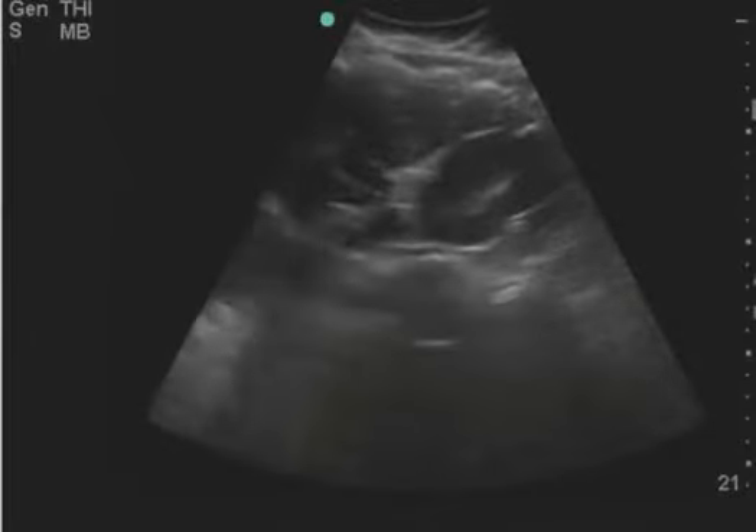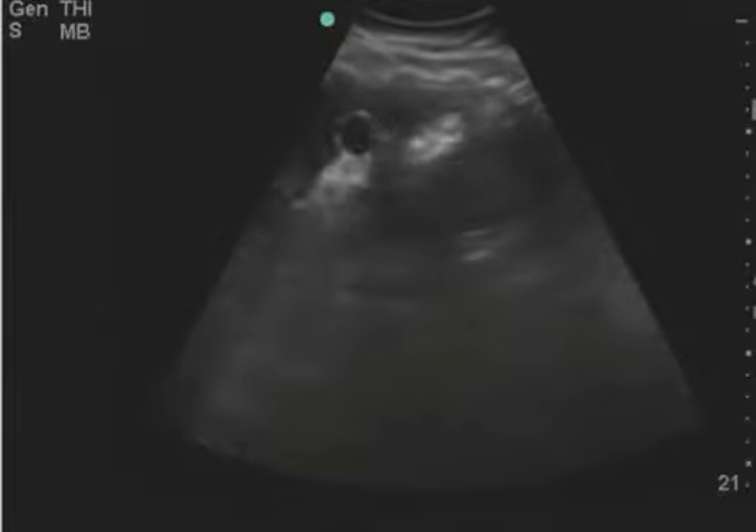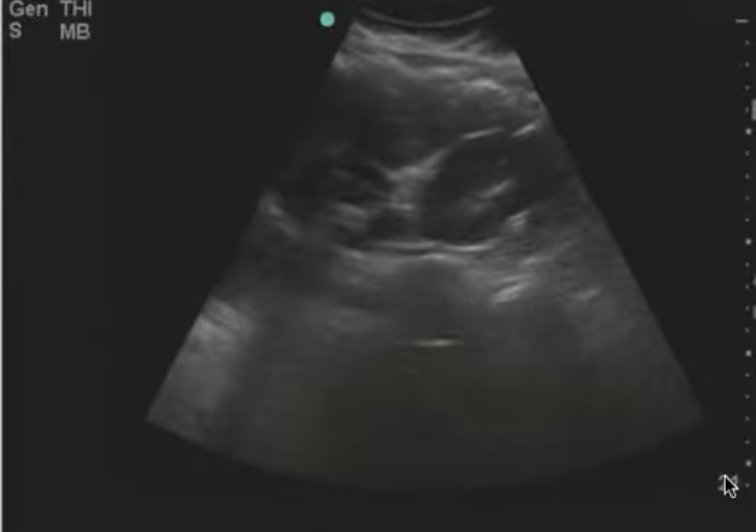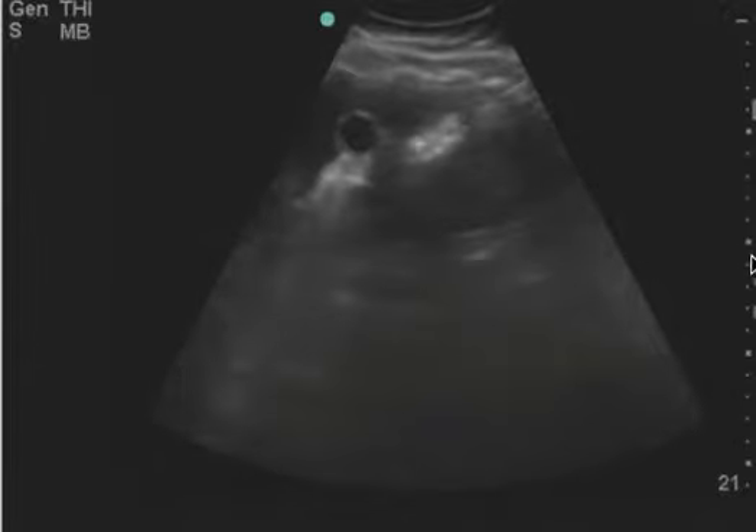This is a gallbladder ultrasound and the only reason why I'm making this video is to illustrate the depth. The depth is set at 21 centimeters, but if you look here, the gallbladder ends maybe around 8 or 9, but definitely not 10.